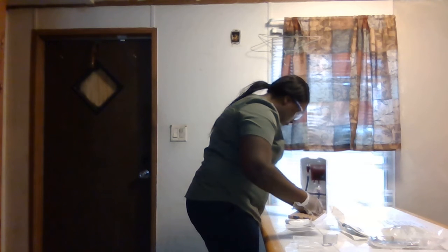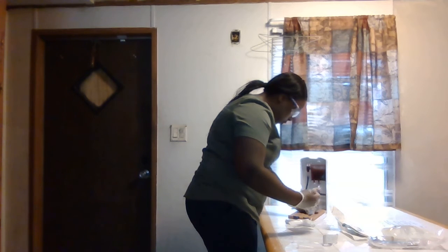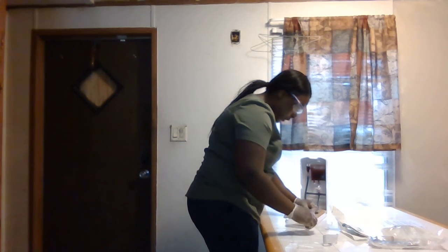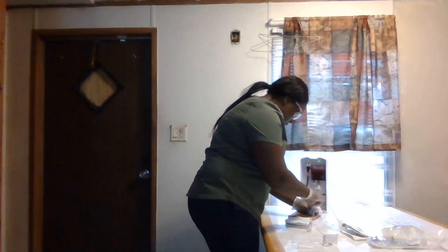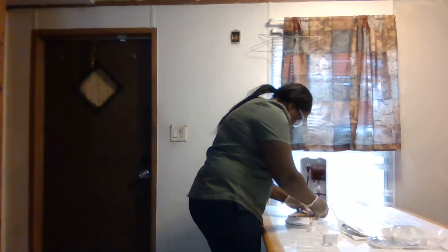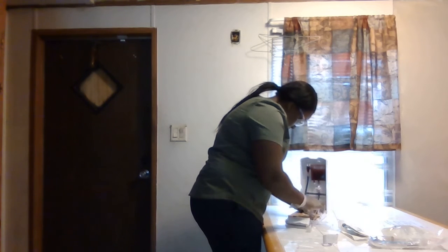And I'm going to pull back to make sure I'm getting blood return, which I am, and I'm going to inject my saline. And while I'm injecting my saline, I'm checking for signs of any infiltration. Alright, so once I have that in, I can go ahead and get my Tegaderm so I can secure it. Never letting go of my catheter. Never crossing over my sterile field. And I'm going to secure my Tegaderm there.